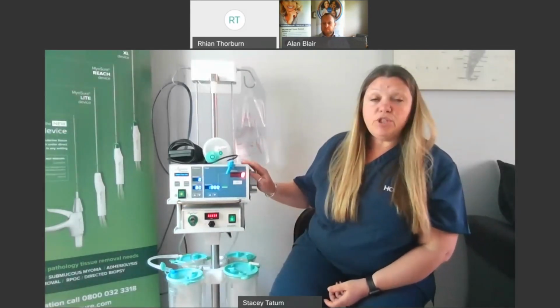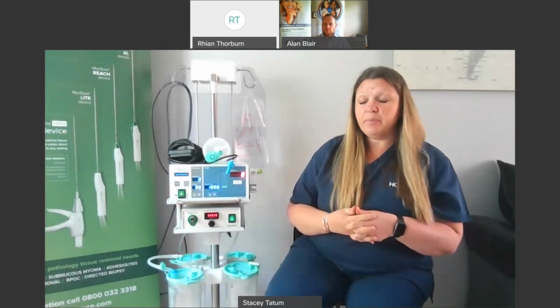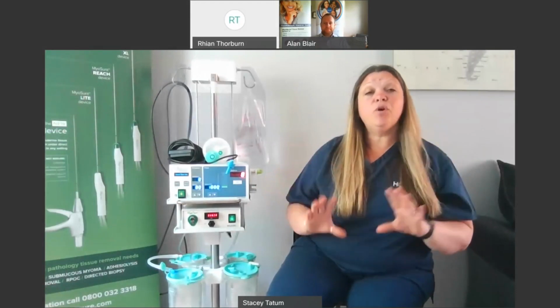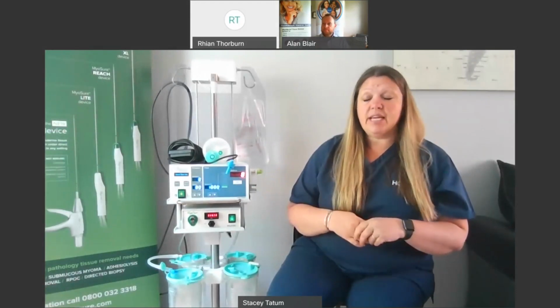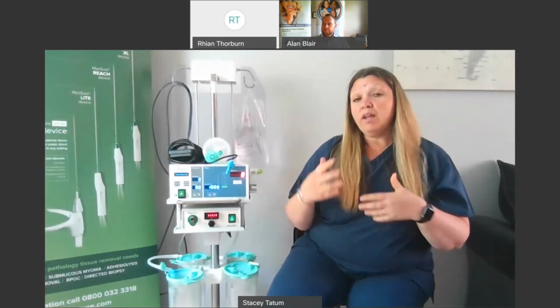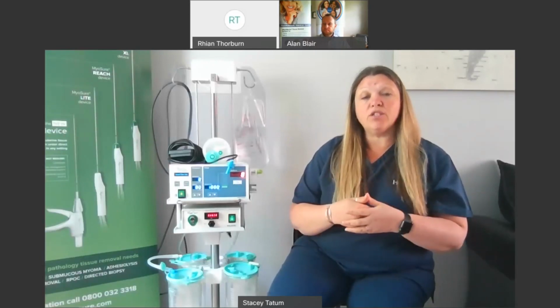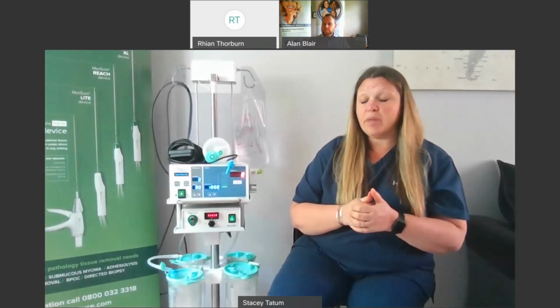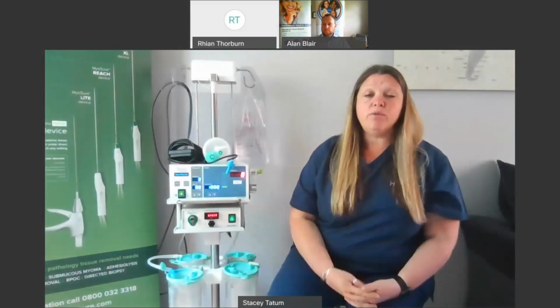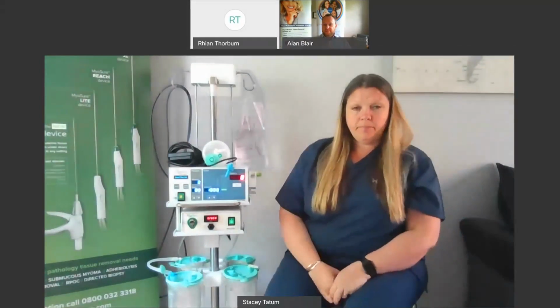So the Aquilex machine, what it is going to do for you is pumping fluid at a pressure that we set. That's going to enable the surgeon to see. And it also can control any bleeding if that tends to happen. And we can do that by increasing the pressure. But whilst it's doing that, it's also calculating what's going in and what's coming back. So it can give you an accurate fluid deficit. So Alan is going to show you a slide and explain in a bit more detail how we would program this interface.